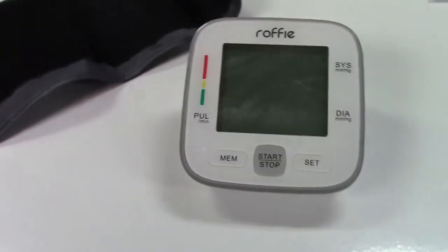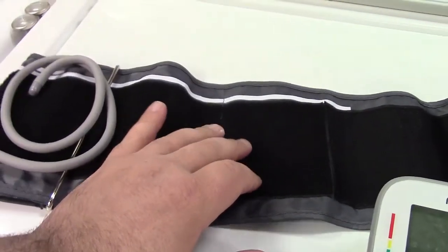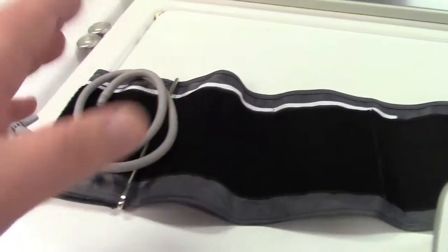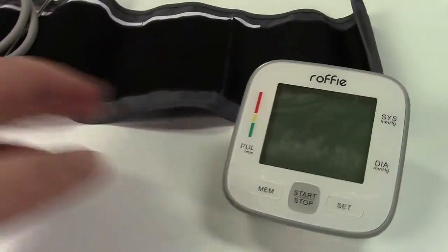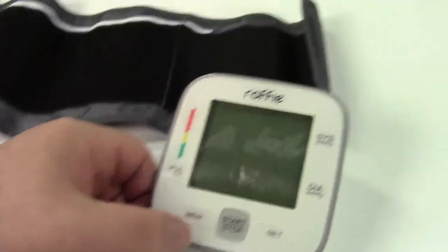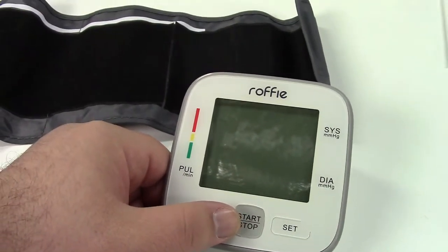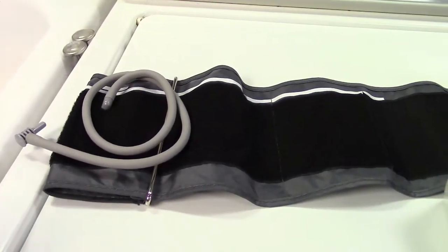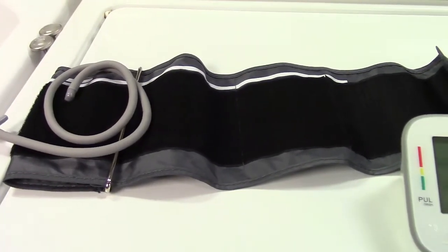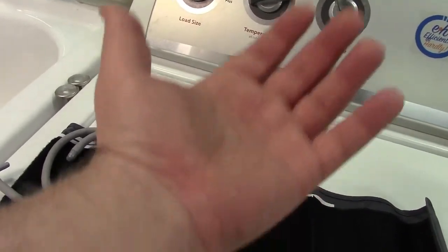It's very easy to use. You'll put the cuff on your upper arm, just about an inch or so above your elbow, plug it into the machine, press the button to turn it on, and press again to take your pressure. Before taking your blood pressure, you should sit and relax for about five minutes. It's recommended to sit in a very relaxed state and keep your arm out with your palm up.